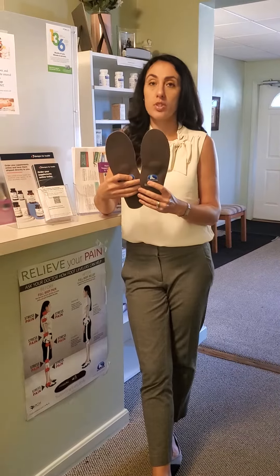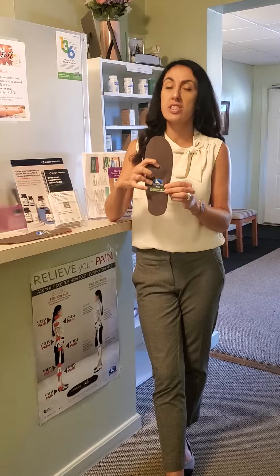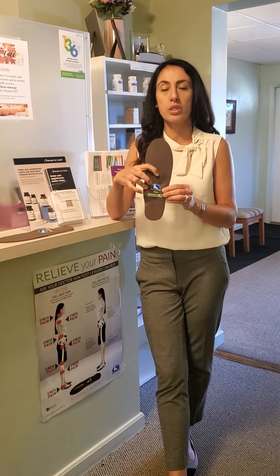Foot Levelers is one of the oldest orthotic companies in this country, and it's the only company that makes an orthotic with three arches — because our foot has three arches, not one and not two — unlike the over-the-counter orthotics, which only take one arch or two into consideration.